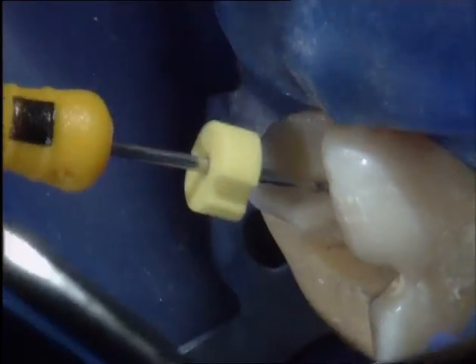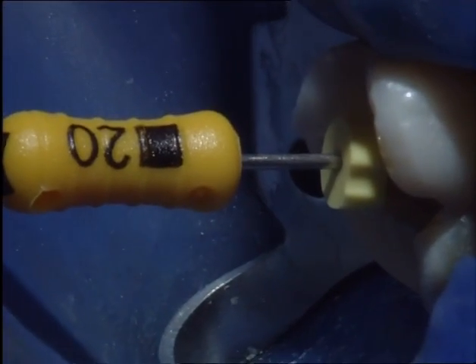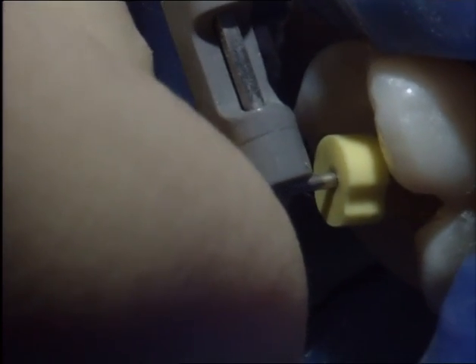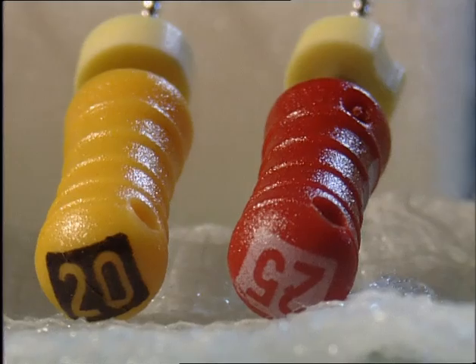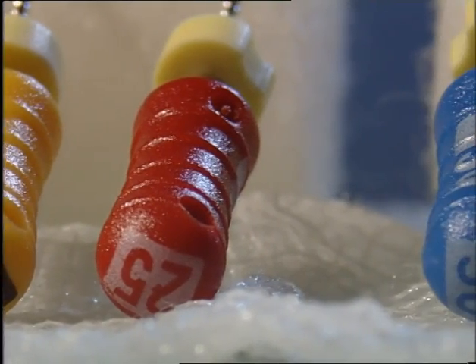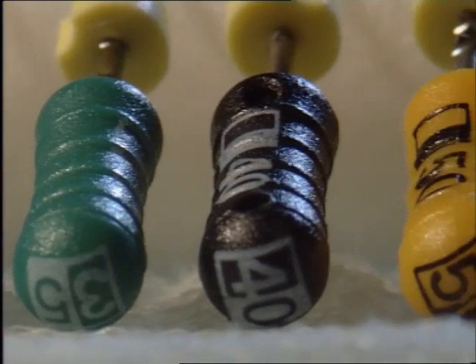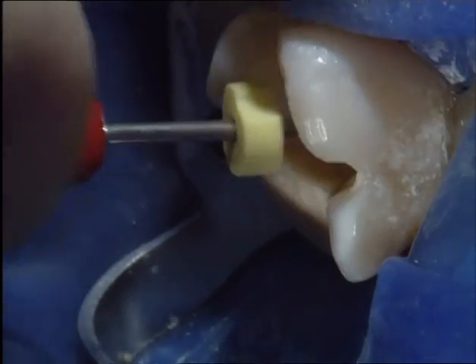After the last recapitulation, the actual size of the foramen is explored with a K file, in this case a number 20 file. The exact position of the file gets checked electronically and radiographically. The final apical shaping is done in a serial step-back preparation. Serial step-back preparation entails the use of a series of progressively larger instruments that are worked, or stepped back, successively further from the end of the root canal preparation.